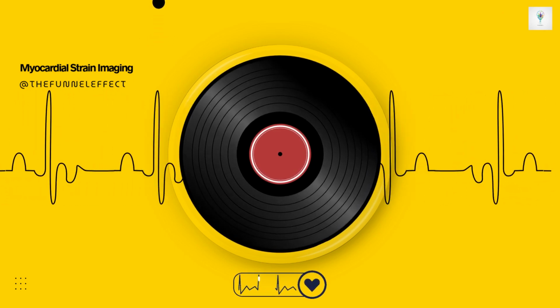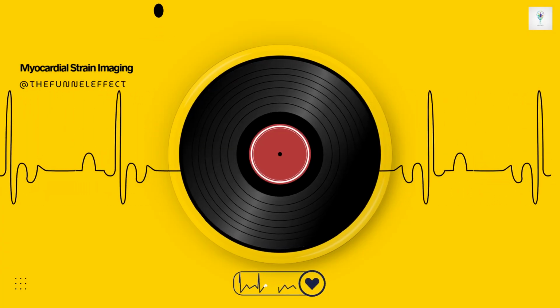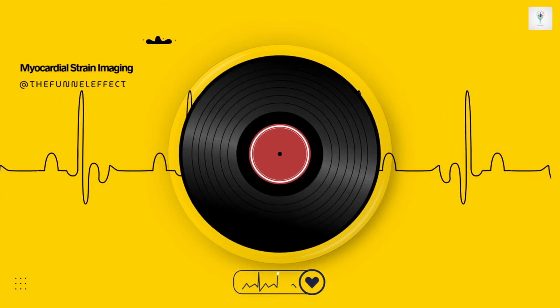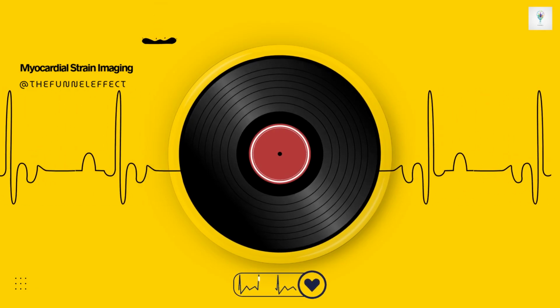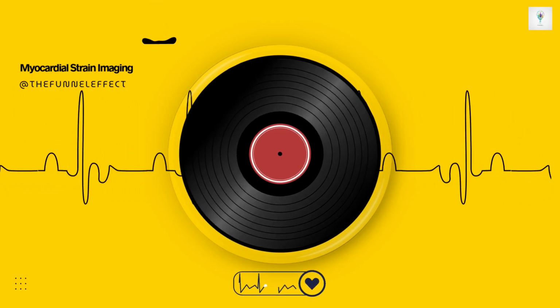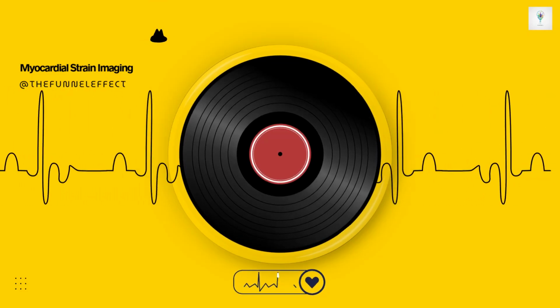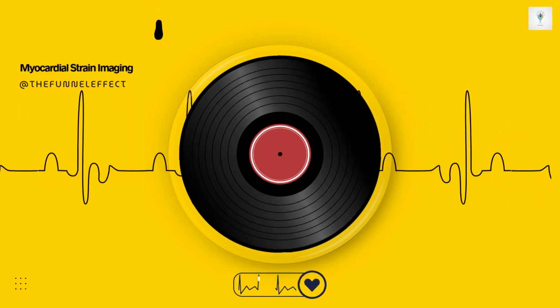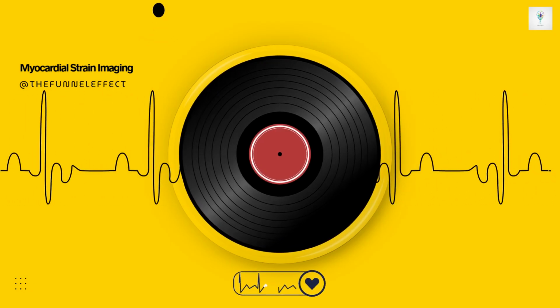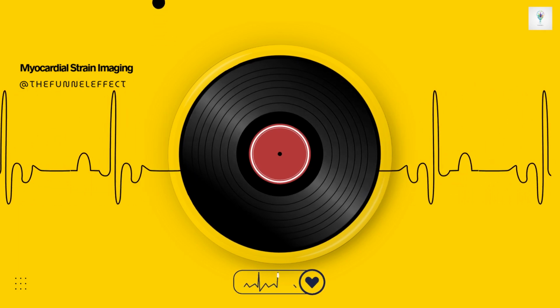The most clinically relevant one is the circumferential longitudinal shear. We usually just call this twist. Twist. Can you break down the mechanics of that? Think about wringing out a wet towel. Twist describes the difference in rotation between two different short axis planes of the heart, usually the apex, the bottom tip, and the base, the top part. So they rotate in opposite directions. Exactly. During contraction, the base rotates clockwise and the apex rotates counterclockwise. This twisting generates torsion, which is actually vital for efficient heart function.